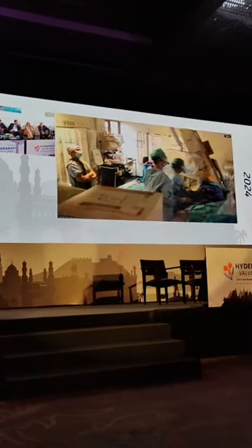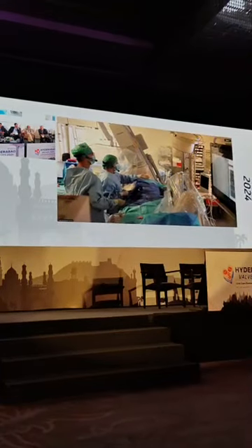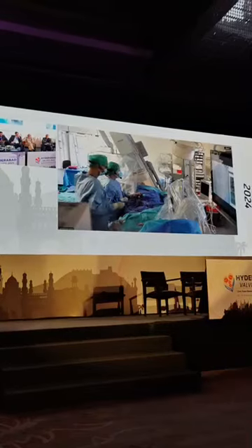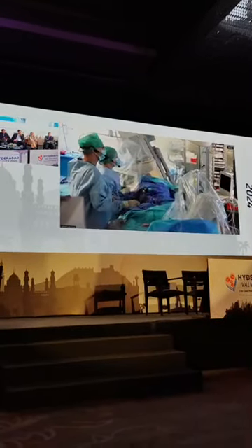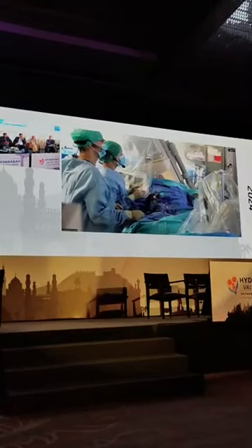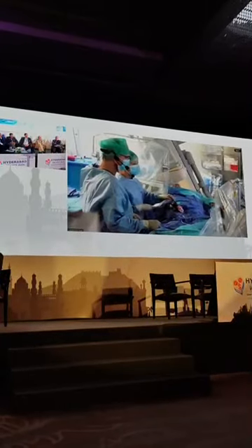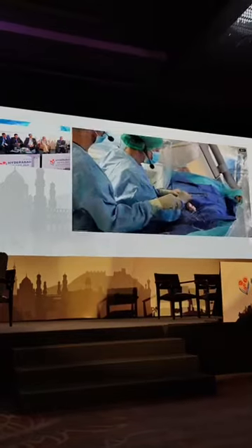We have also the echo machine, which is in the room. It is very important. It was used for the echo-guided puncture, but we also need to have echo in case anything happens. You need to be able to do an echo immediately to see if the patient complains of something, or if you have low blood pressure. So now we will re-advance the extra stiff wire.